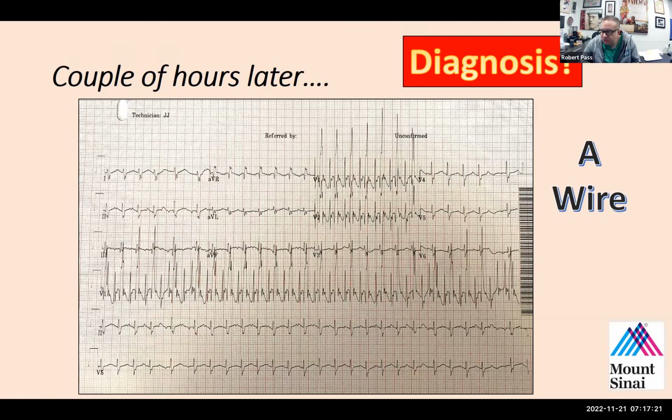When you're A-pacing, if you go into this type of rhythm, the likelihood is high that it is iatrogenic. What would be a good explanation for why it might happen? Maybe undersensing? Okay, I agree with that, but maybe you could expound upon that.